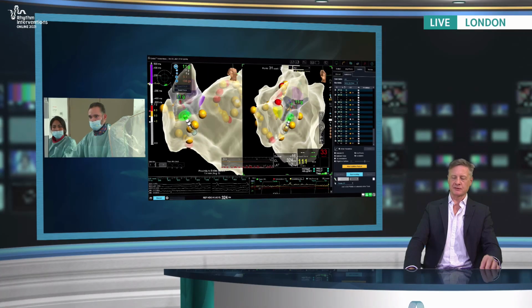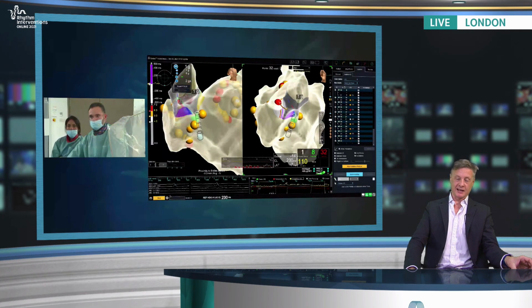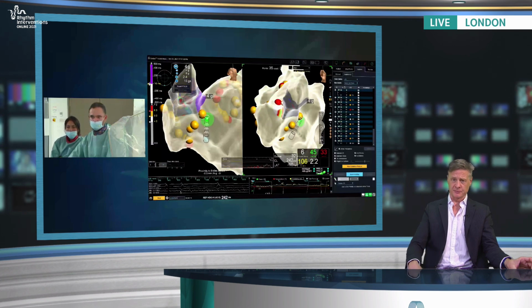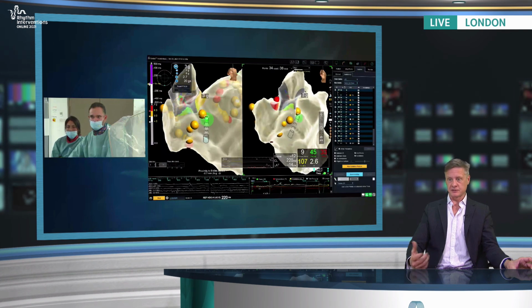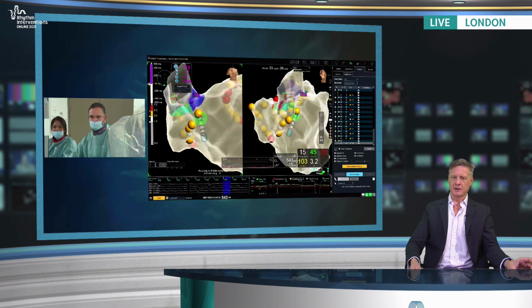But we're falling into the trap of being so convinced by the approach and technique that we use. We think that does better than just isolating the pulmonary veins. But as you've all pointed out, it's important that it is proved, or at least that the individual is satisfied it's really true. We've fallen into the trap that STAR AF showed very nicely, that whatever we do doesn't seem to improve outcomes at the moment. Unfortunately, we were planning to do a multi-center trial examining some of these technologies like STAR, and COVID got in the way and stopped us. So your point is well made that good data is still really critical.